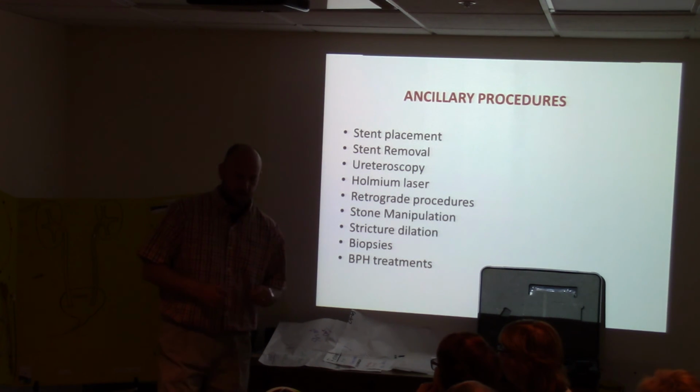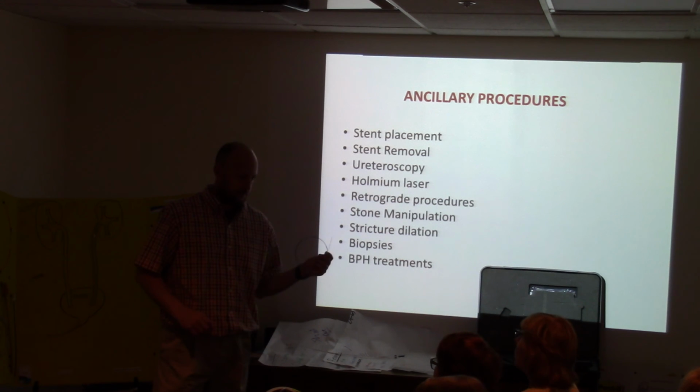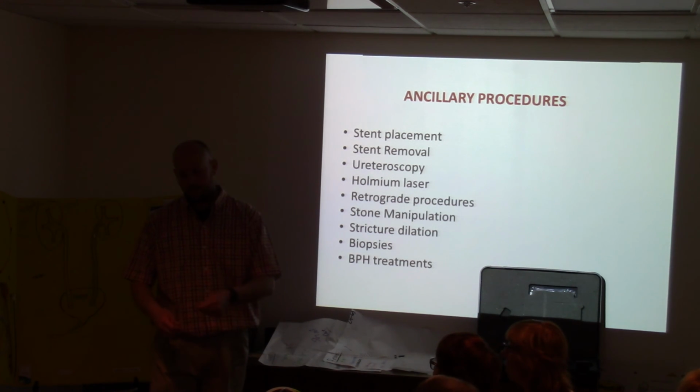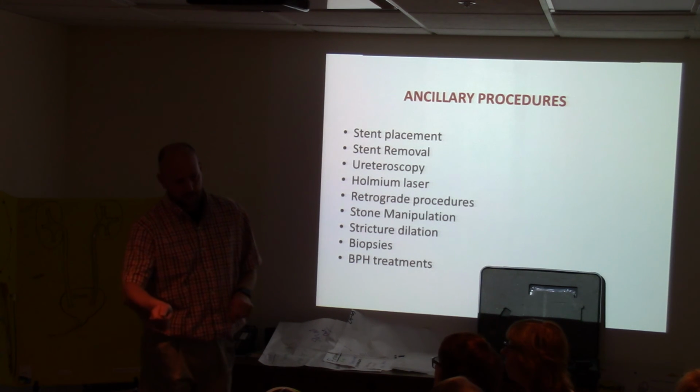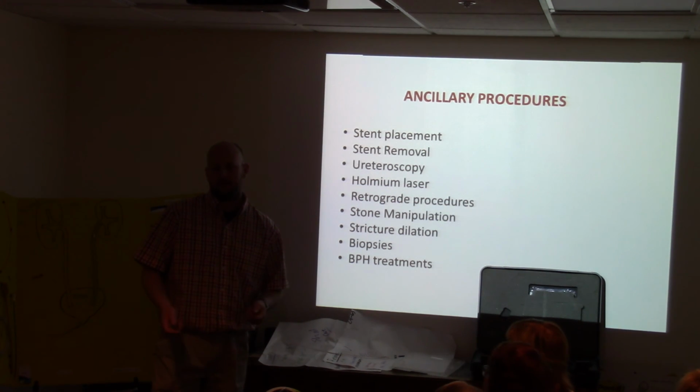The doctor will access the ureter, and then they'll say, okay, let's open a 365 fiber, and we'll give it to the nurse and she'll open it. Then they'll put it up, and we'll attach it to our machine, and choose the settings we need, depending on the stone and where it's at. Then the doctor will step on the pedal to break the stone up, and he's looking at it the whole time.